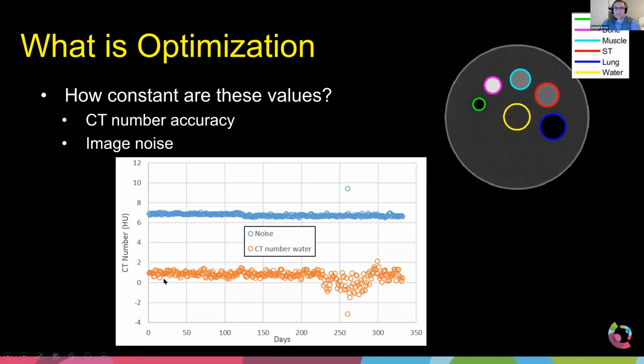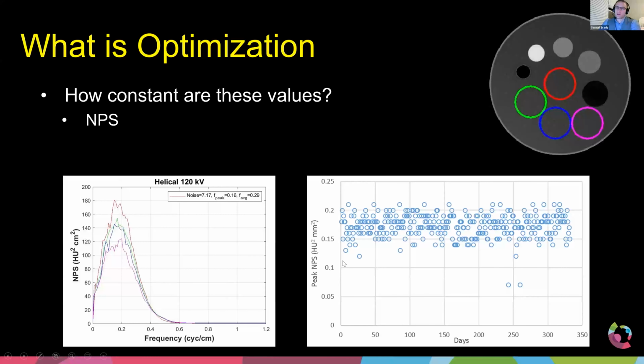So when the system is functioning properly, which you would expect it to, you can see the CT number is consistent. Now, we also talked about noise power spectrum in our first week, which gives you an estimate of the total noise variance in the image and the texture of the noise. Is it going to be coarse and blobby, or is it going to be sandy, really fine? Here I'm measuring the noise power spectrum in various different areas in the water. And that's what you can see here. The color of the plots corresponds to the color of the ROIs over here.